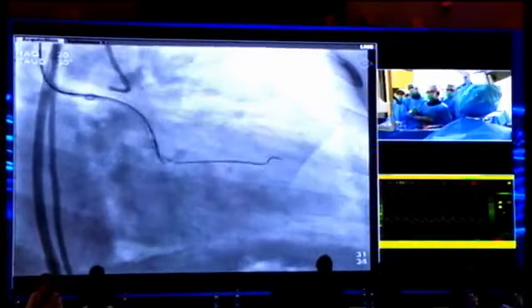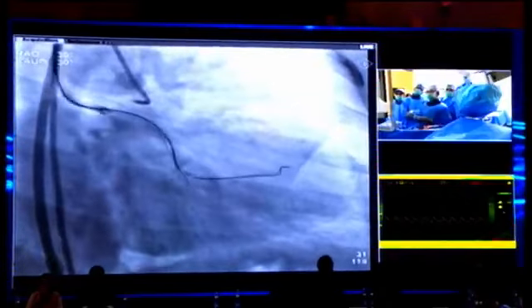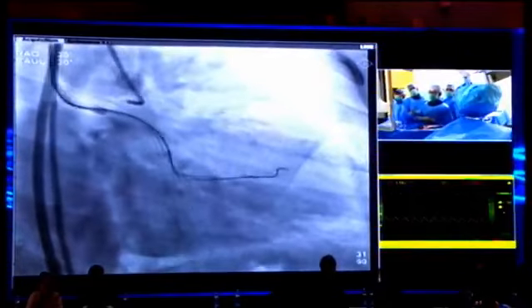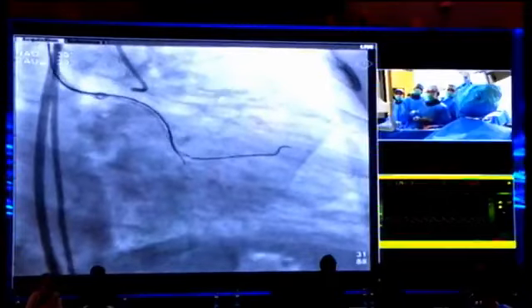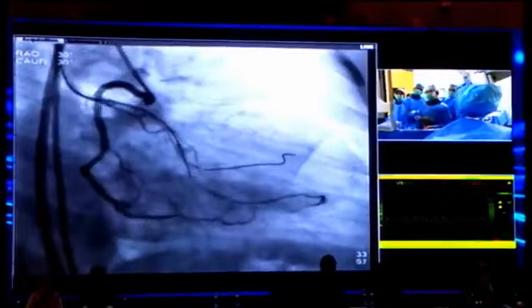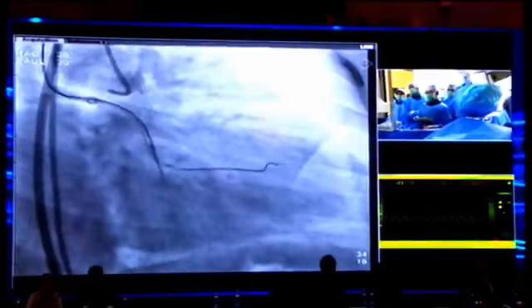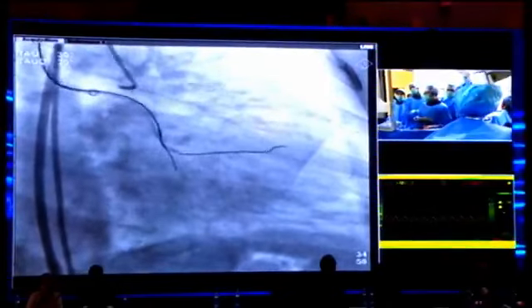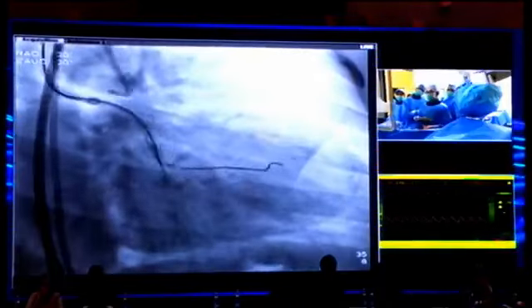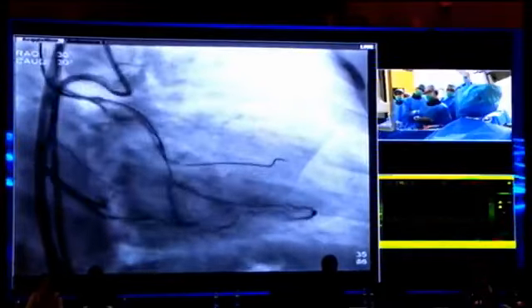And from this fluoroscopy, we can see the deflection and the moving. A little bit this guide wire advanced to the left side. Can you see that? A little bit of movement. Yes. And after that, I checked again from the contralateral. Yeah, looks okay. I advanced only about 1.0 millimeter like this, and I checked again from the contralateral injection. Still this direction is not so bad.